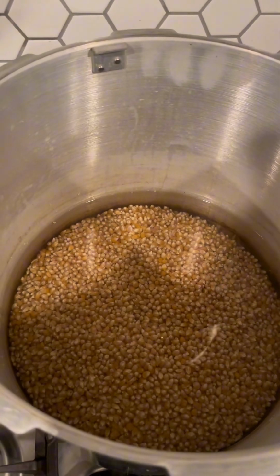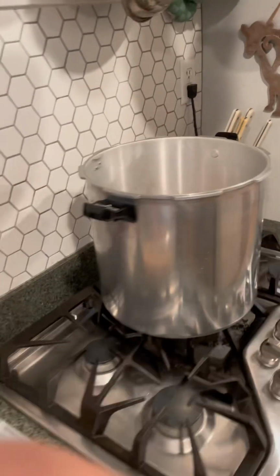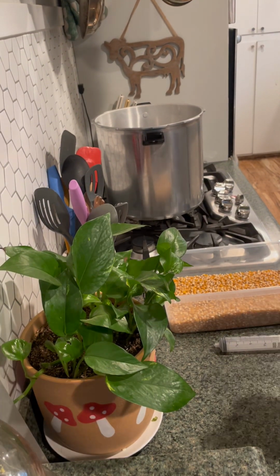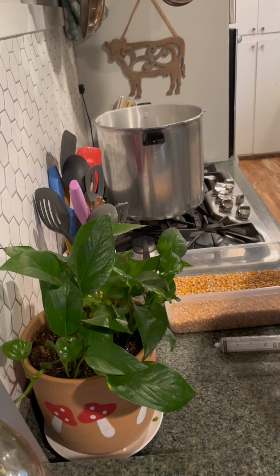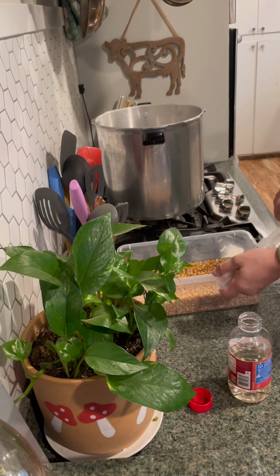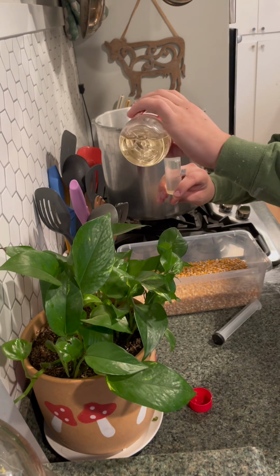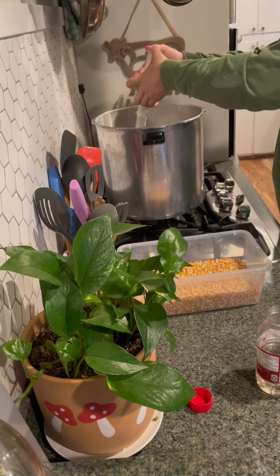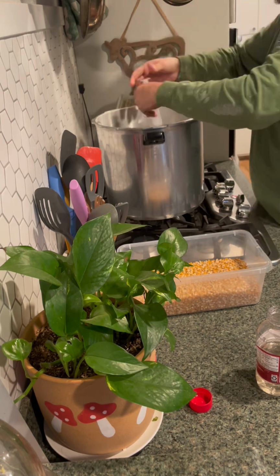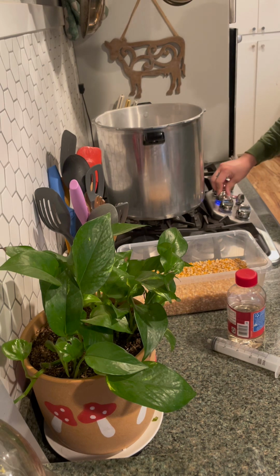All right, so now I've got my 4 pounds of corn in there, and I put in exactly 5 quarts of water. First, we're going to be doing the drippy corn. So I'm going to measure out 1.5 ounces corn syrup, which is 45 milliliters. So now I've got that in there. I'm going to get the burner going.